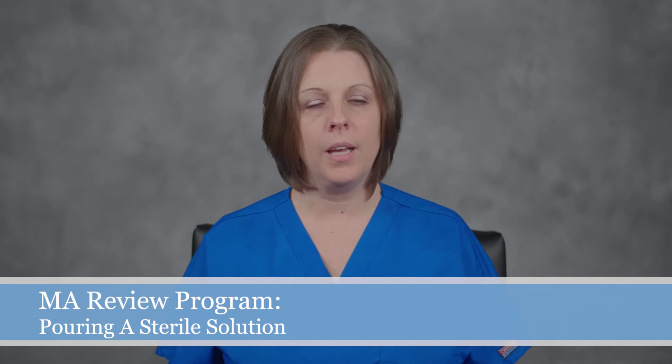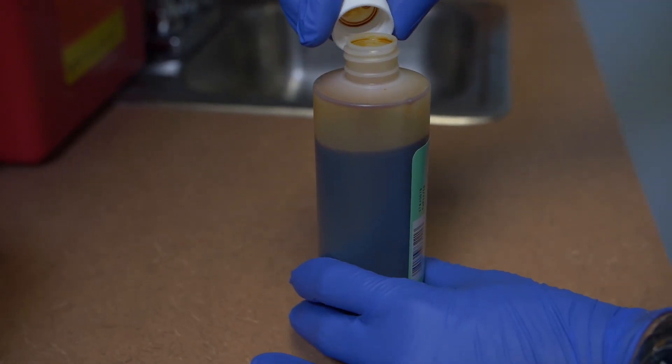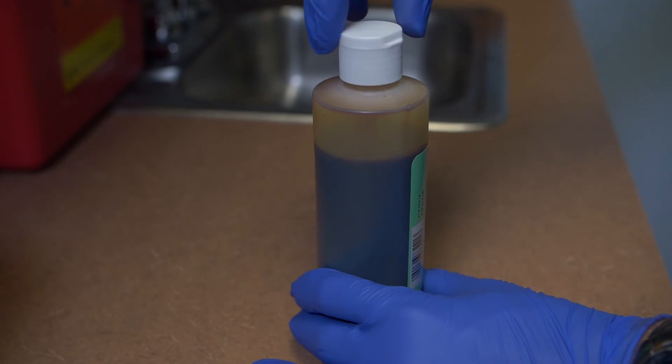Precautions should be taken to avoid splashing, spilling, reaching over the field, or touching any of the sterile surfaces. Replace the cap of the solution container using sterile technique.